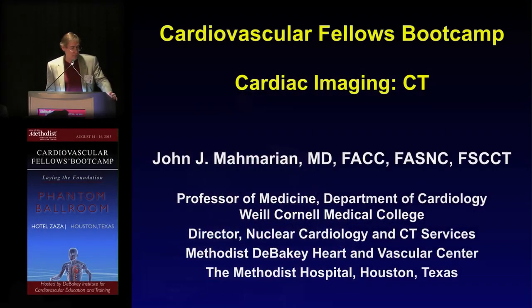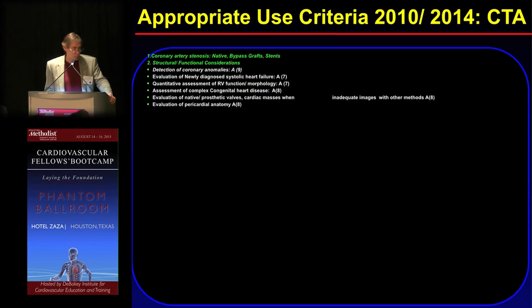So in the last 15 minutes, I'm going to talk about cardiac CT, and I also am not going to bore you with a lot of technical aspects of CT because, frankly, there are a lot of issues that arise in terms of imaging patients. But I'm going to talk about how we can utilize CT, and obviously one of the most common reasons is for detecting coronary artery stenosis, native vessel disease, bypass grafts, patency of stents, et cetera.